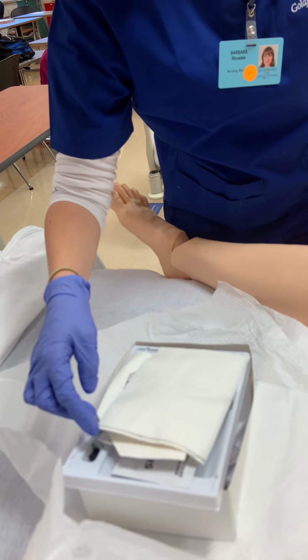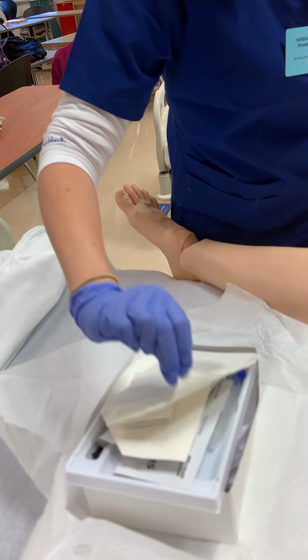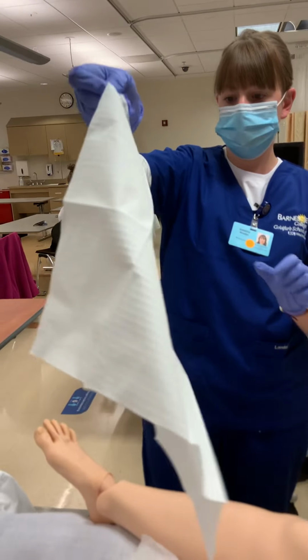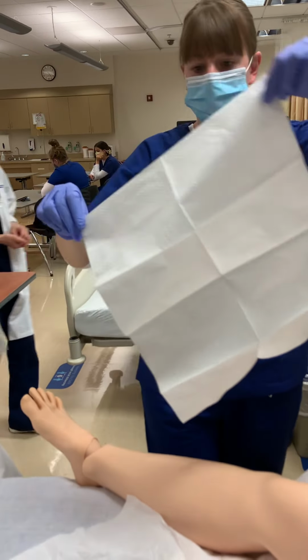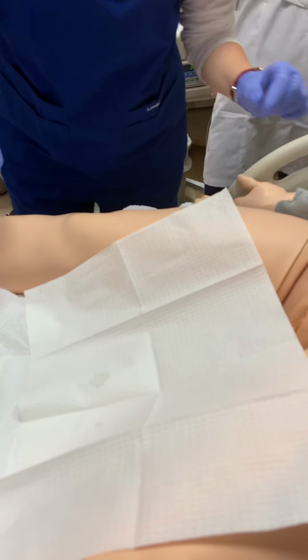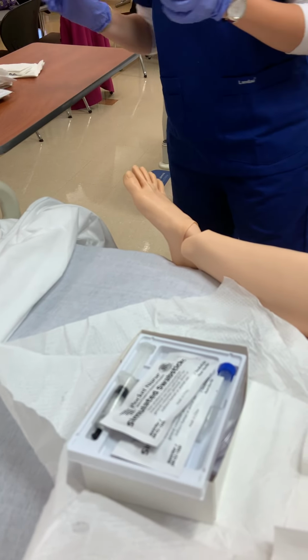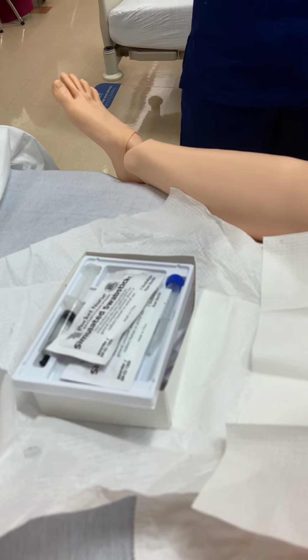Find the corner here. We'll be needing these items. Okay, so now I'm going to put on my sterile gloves.